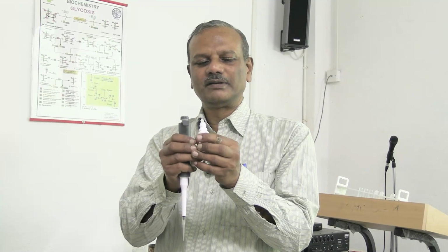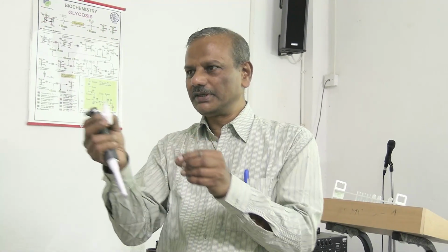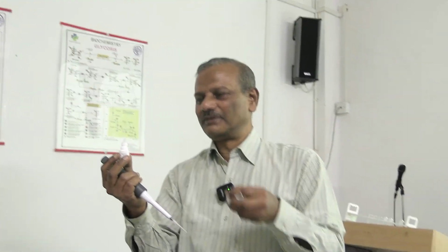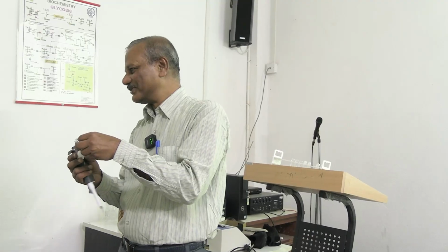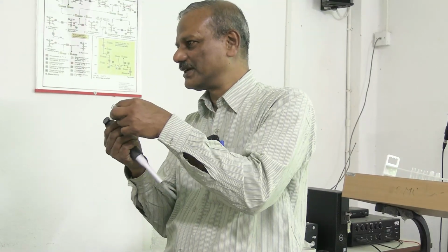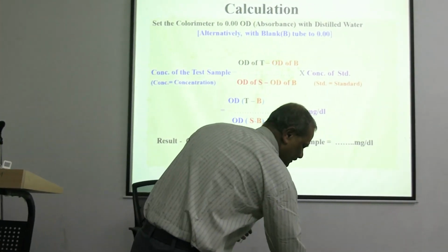You open it, or there will be a procedure: you will be provided with a small test tube so that this is protected. This is the actual material. It is just like a weight, say 100 milligram. For gold, a particular weight cannot be manipulated. Here it is basically the same thing, no contamination. So this part is clear.